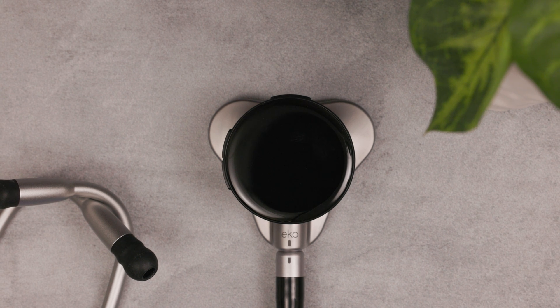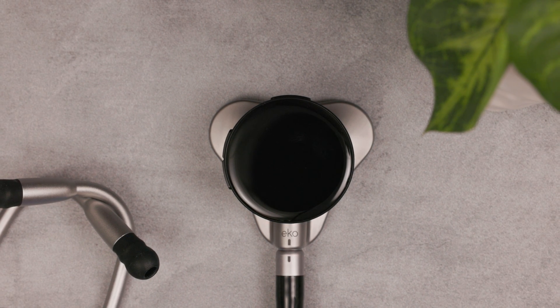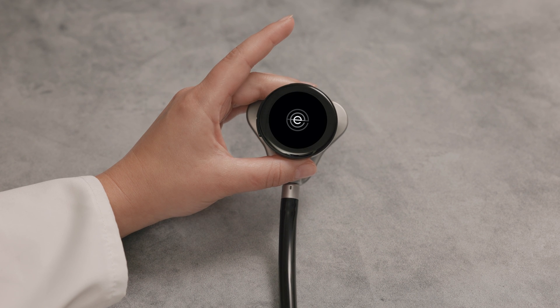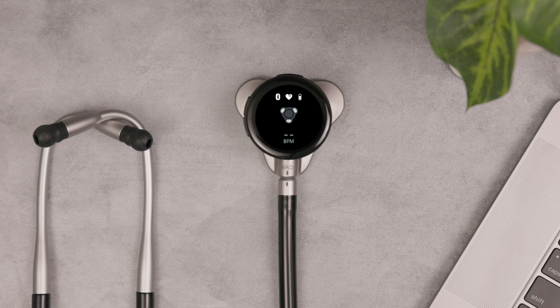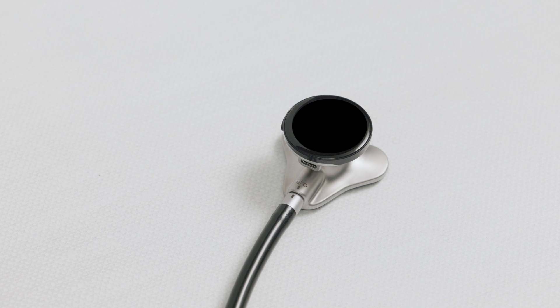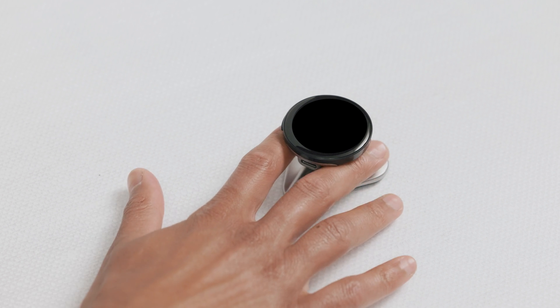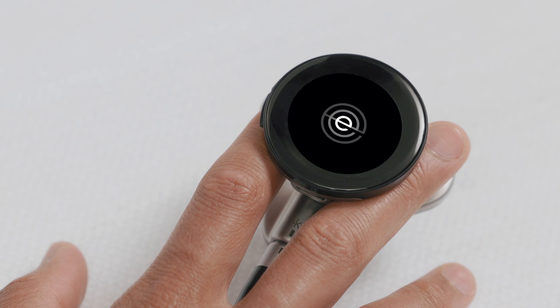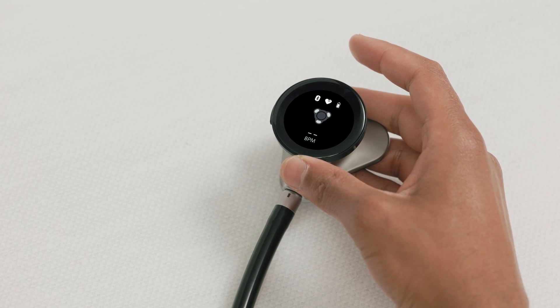Now let's turn on and turn off the device. To turn on the device, press the top button. The Core 500 automatically goes to sleep after a short period of not being used. Pick it up on the neck of the chest piece to wake it up. To turn it off, press the top button and the volume up button at the same time.